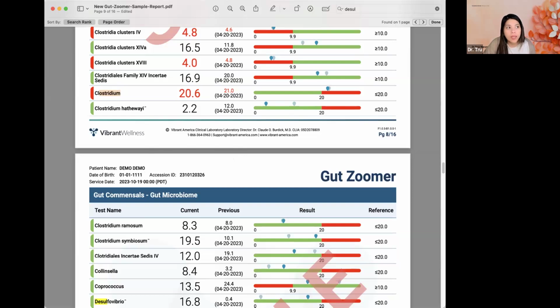Now, in the slides, you're going to see that there are other tests you could do to identify this, because this only represents part of the microbiome. You have to learn to not take everything at face value because there are other variables. So there are other tests that you can run to get a better picture of how these guys are affecting your health. One of them is organic acid testing. I just want to mention that so you know that that's available.